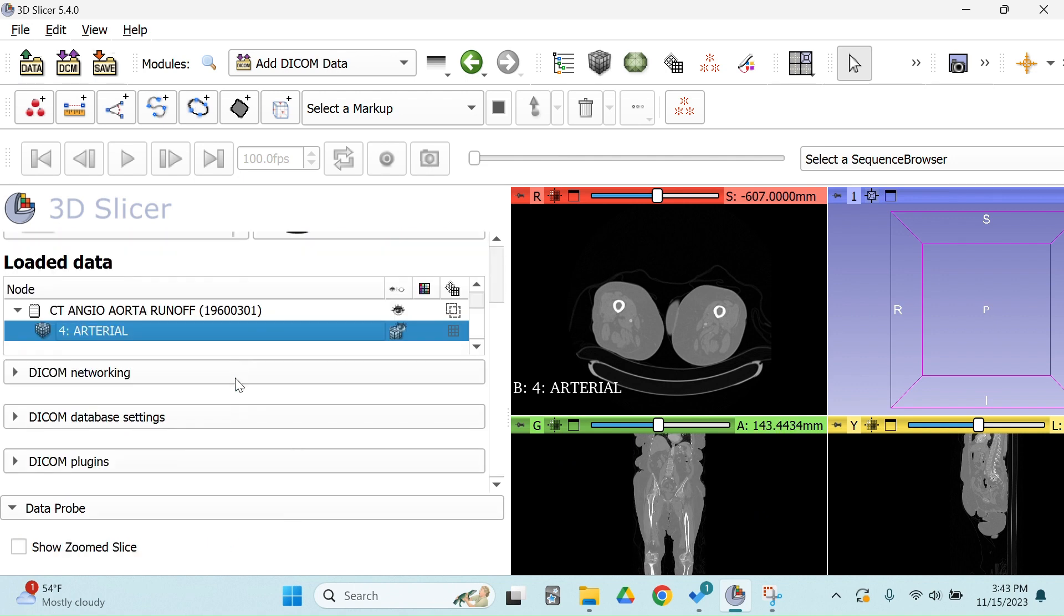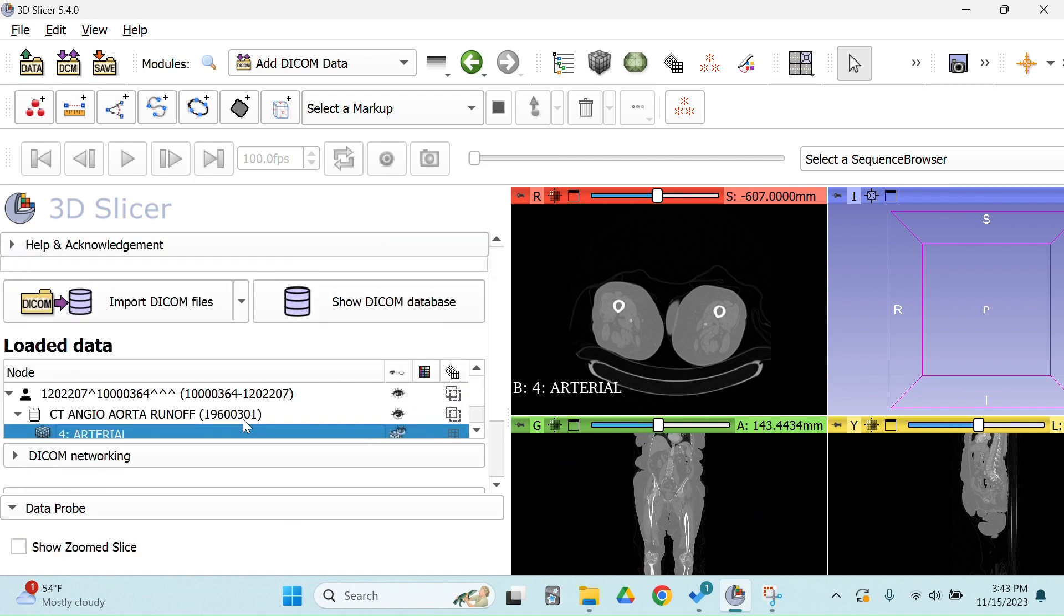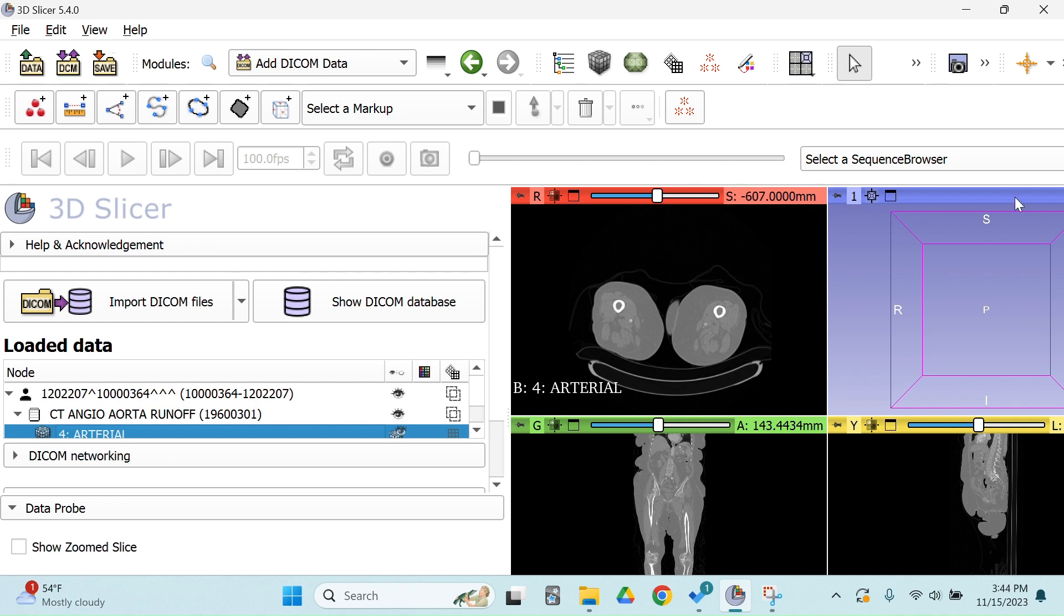And our next step is going to be turning this into a volume and using that volume to reconstruct. So that is going to be step two, and I'll be right back.